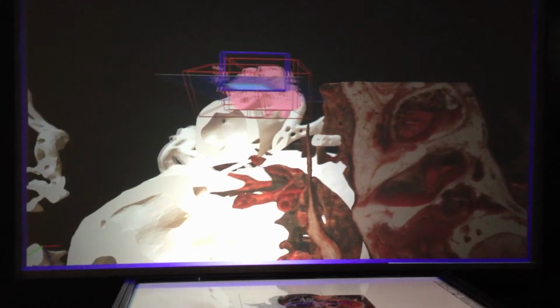So we've got data from the Visible Human Project, which is a National Institutes of Health initiative where they basically took slices of a human cadaver and then, similar to a CT scan, we're able to take those slices, stack them back up in 3D.